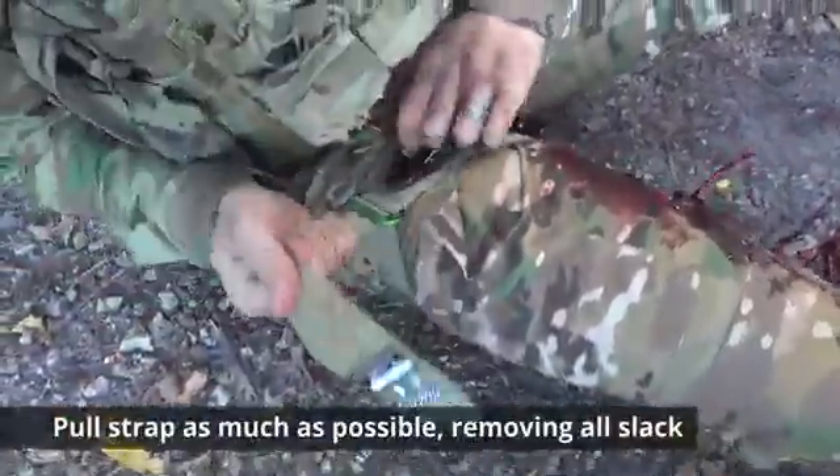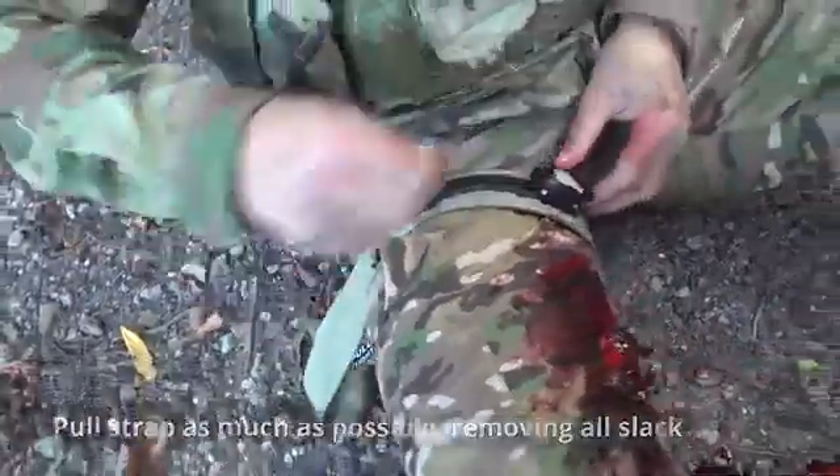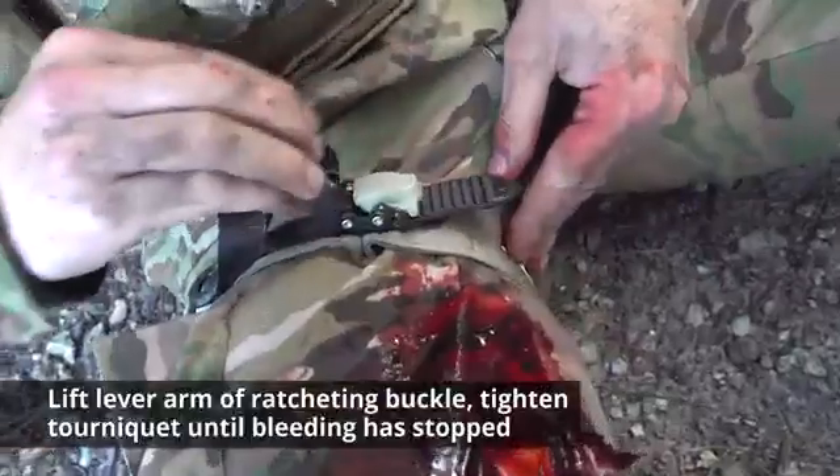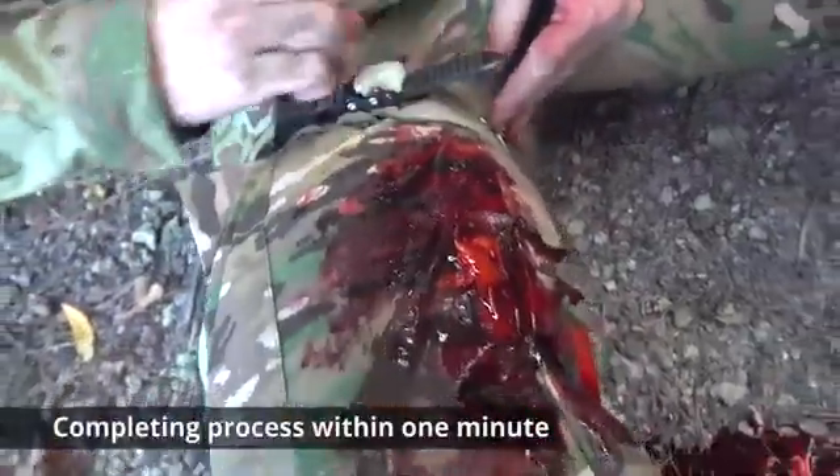Now pull the strap as tightly as possible, removing all excess slack. Lift the lever arm with the ratcheting buckle and tighten the tourniquet until bleeding is stopped, completing the process within one minute.